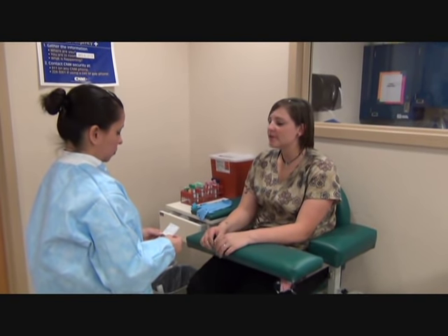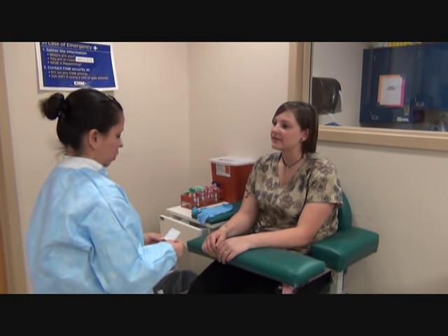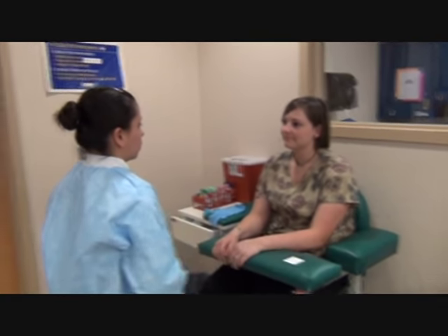Can you please state your name and date of birth? Candice Hillerman, 08-03-1990. I'm going to go wash my hands and glove up. I'll be right back.